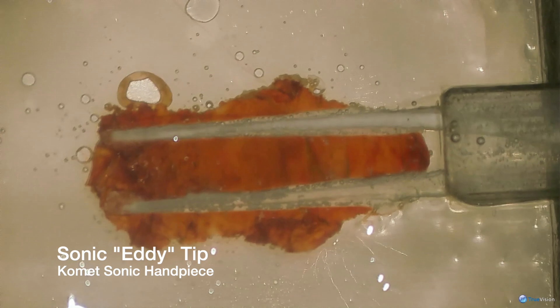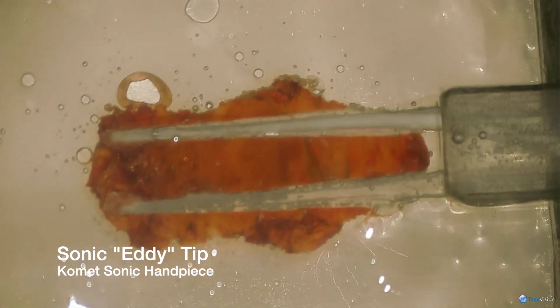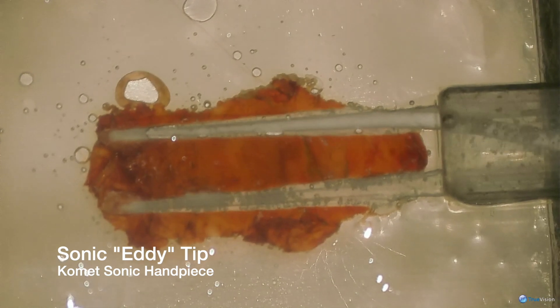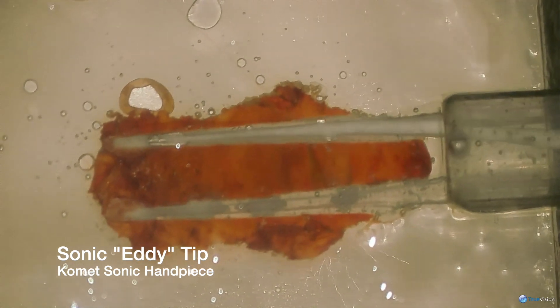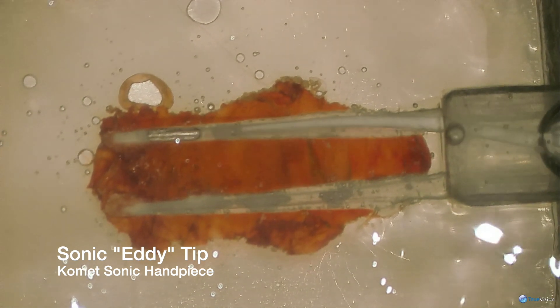Now the solution is being activated with the sonic eddy tip. We see activation along its whole length. This is a plastic tip, extremely safe, can't hurt a canal.